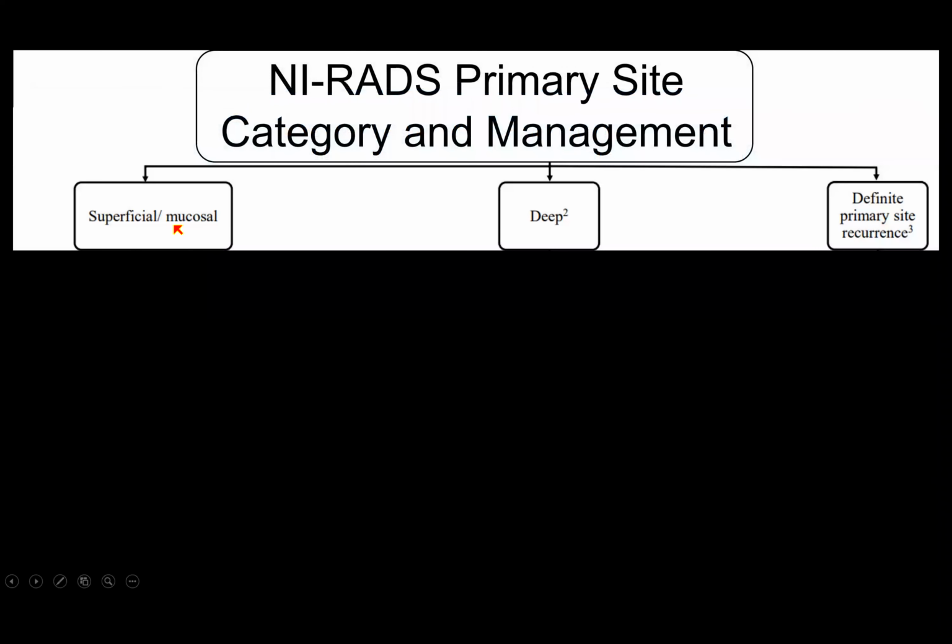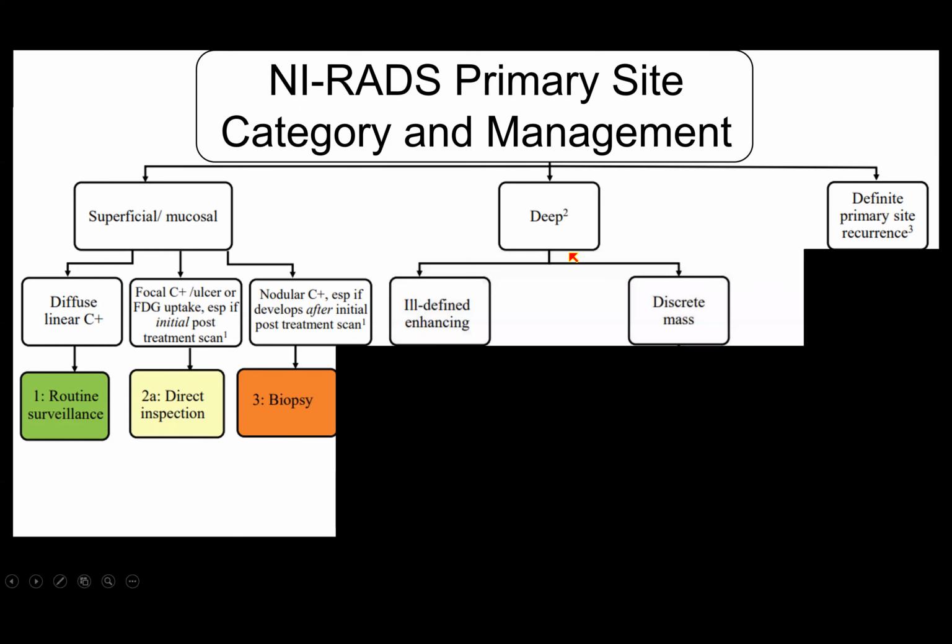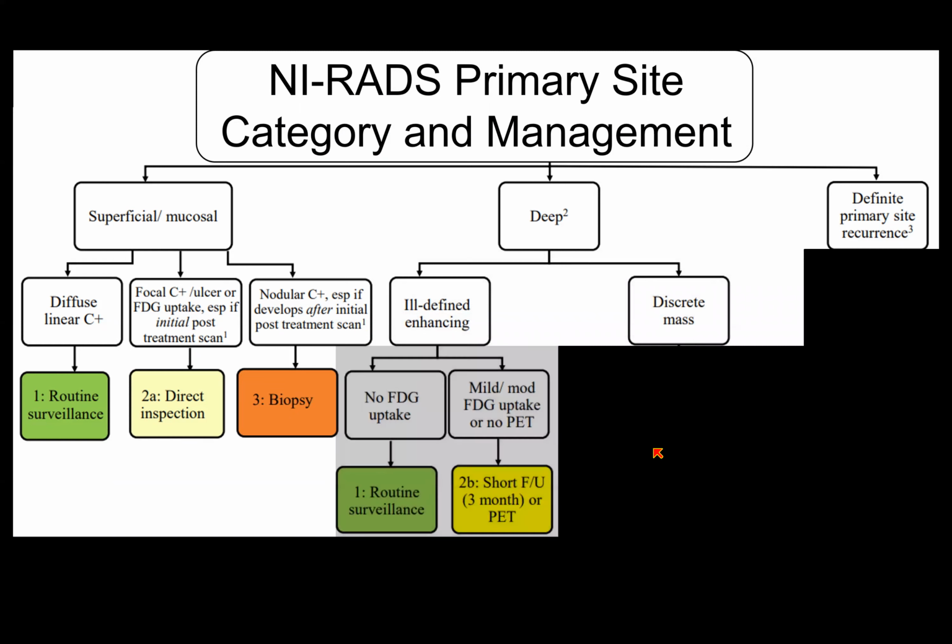So for the primary site, whether it's superficial, deep, or definite, if it's superficial, we think about that enhancement. Is it diffuse and linear? Is it focal or nodular? That's going to recommend management. If it's deep, it may be an ill-defined or discrete mass.